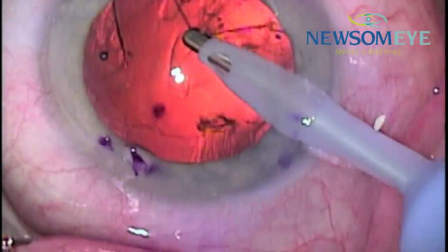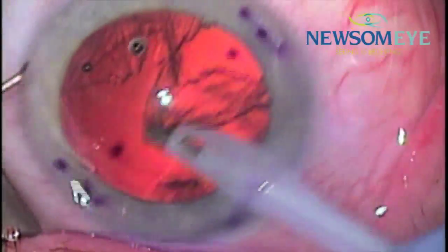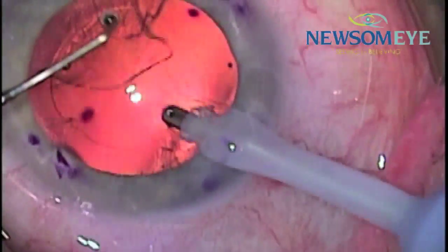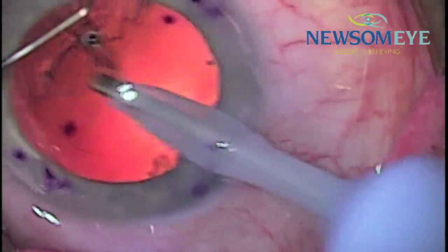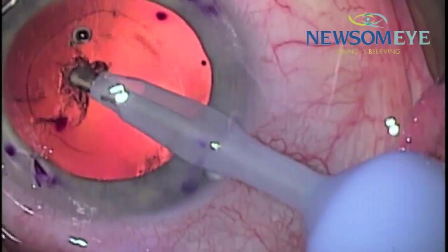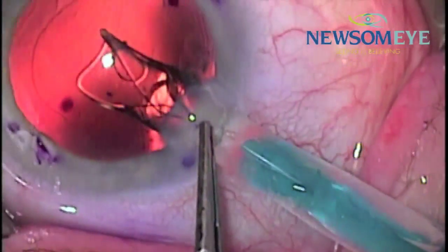Once the cataract has been fully removed, we then use an IA, which is like a small vacuum tip, to remove any small residual cortical material and leave a nice clear bag in place for where the lens will be inserted.